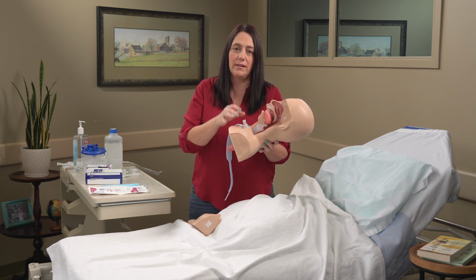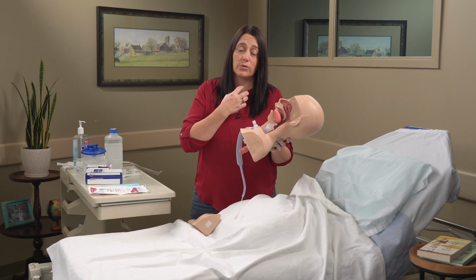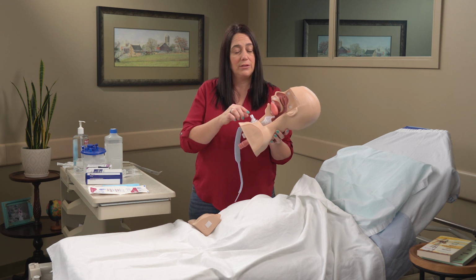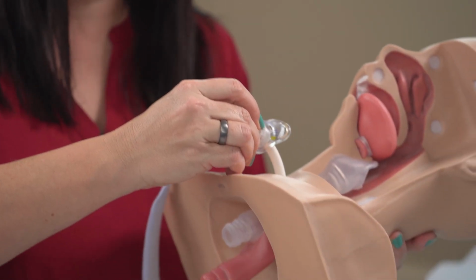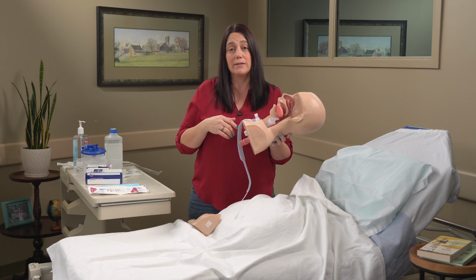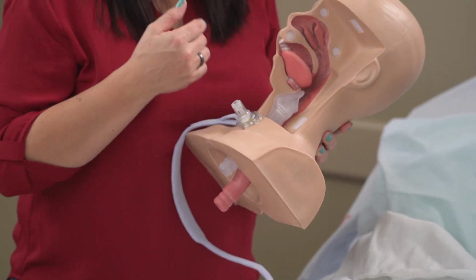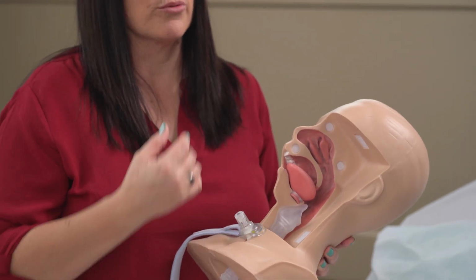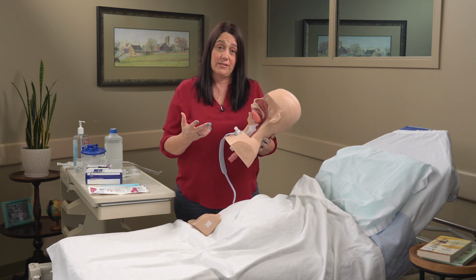So without this, that hole or that incision that was created, that ostomy site, would begin to try to close on its own. So the device has to be left in place to keep that site open so that person can continue to breathe. So that's all it is. It is as simple as a straw that's placed into that person's trachea to help them keep breathing and keep their airway open. There are times when a person will have a tracheostomy placed and the issue up above in the airway that was causing the problem will resolve itself and the tracheostomy can be removed and the site can close up. There are other times when the person will need that tracheostomy for the rest of their lives.